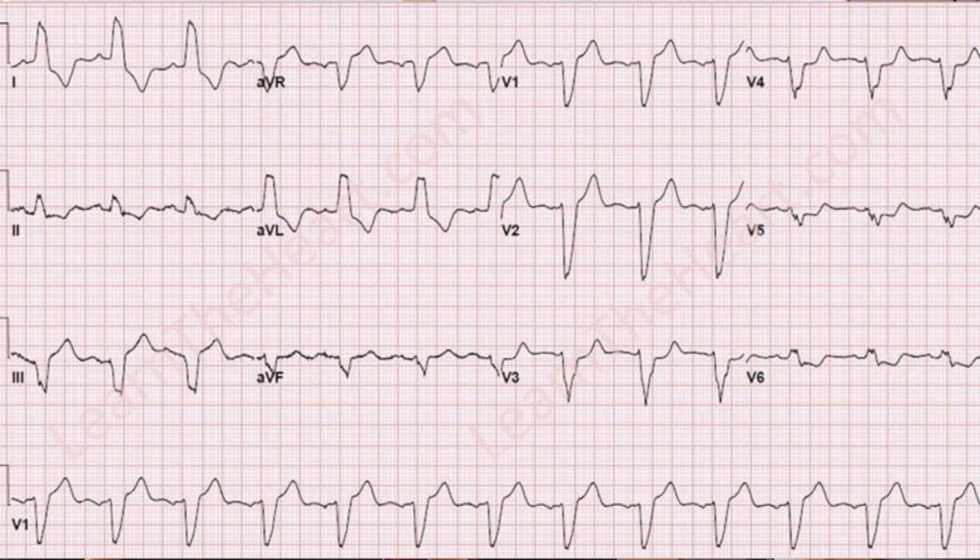So let's look at an initial normal left bundle branch block pattern on an EKG. You've got a widened QRS. In the precordial leads V1 through V3, specifically, you usually have a big deep S wave, a big negative deflection, followed by a return that overshoots and causes a little bit of ST segment elevation. It's very easy for us to look at this and initially get concerned, maybe the patient's having a STEMI, this is some ST segment elevation, should I be concerned about this?